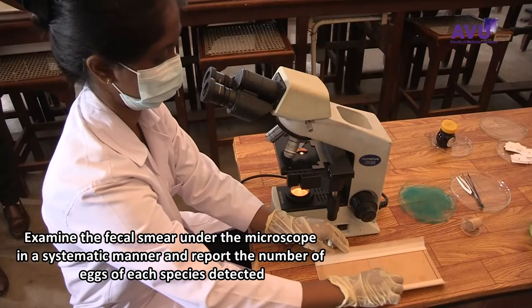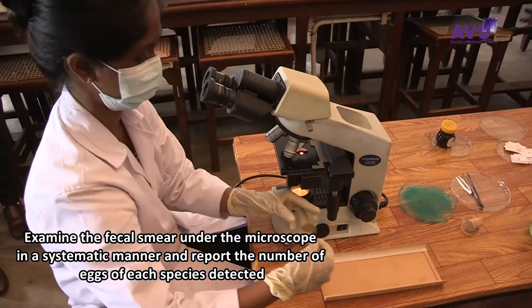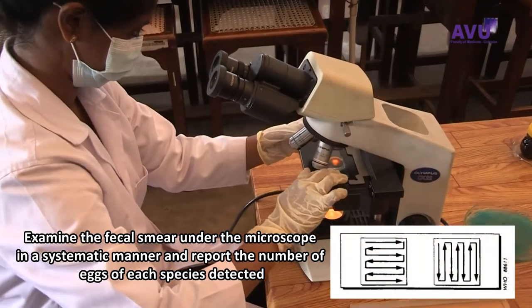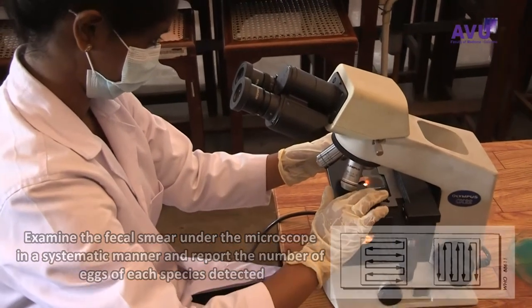Examine the faecal smear under the microscope in a systematic manner and report the number of eggs of each species detected.